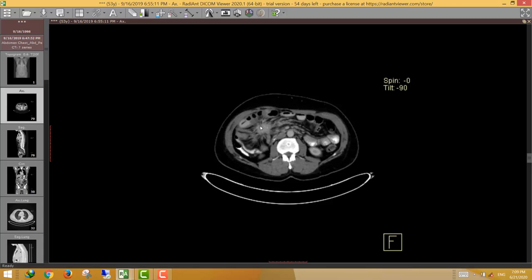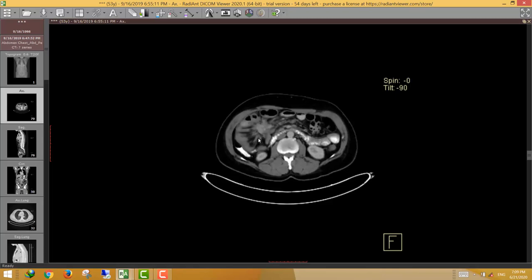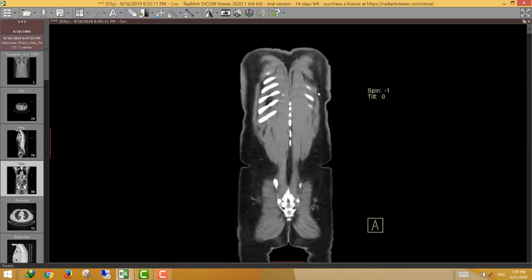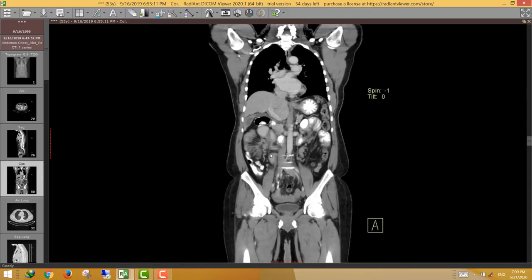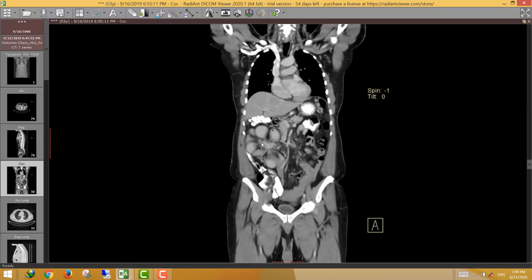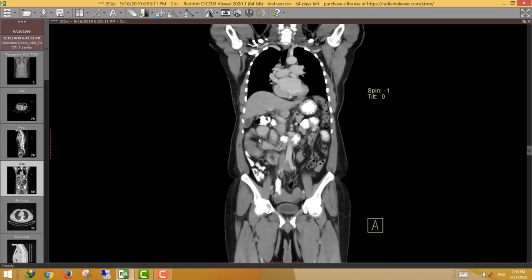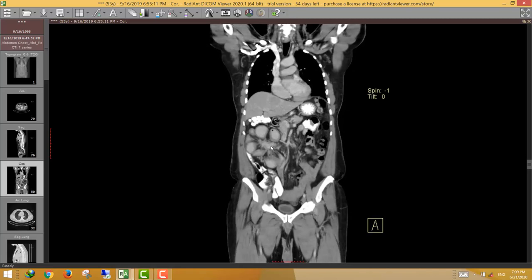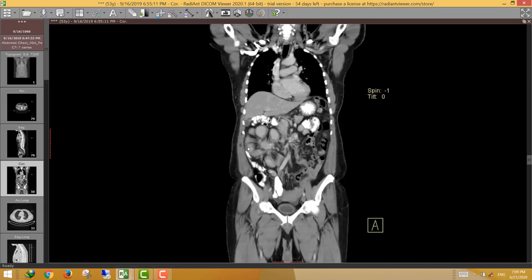We have a spiculated mass lesion at the right lumbar region with a characteristic extensive desmoplastic reaction, causing adherent tethering of the surrounding ileal bowel loops, with small foci of calcification within the region. All these features are characteristic of mesenteric carcinoid.